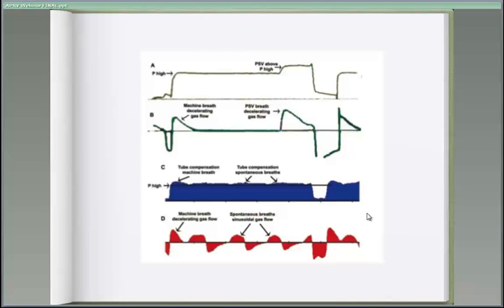This is one of the reasons why I believe that mixing modes or applying pressure support to APRV is dangerous and perhaps doesn't even make sense from a physiologic perspective. First, anytime you add pressure support, you actually are going to change the flow pattern from this typical sinusoidal pattern of spontaneous breathing to a decelerating flow. Second, all the limitations and the feedback that the brain has to control the respiratory muscles are overridden because now you can force airway pressure onto the patient, whereas the natural limitation, as lung volume increases, the power that the diaphragm can generate diminishes, is overridden.